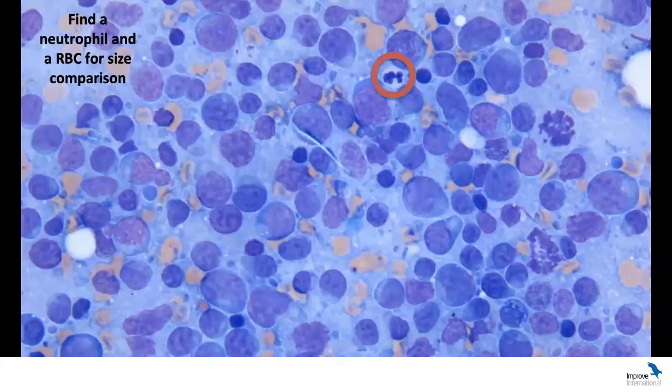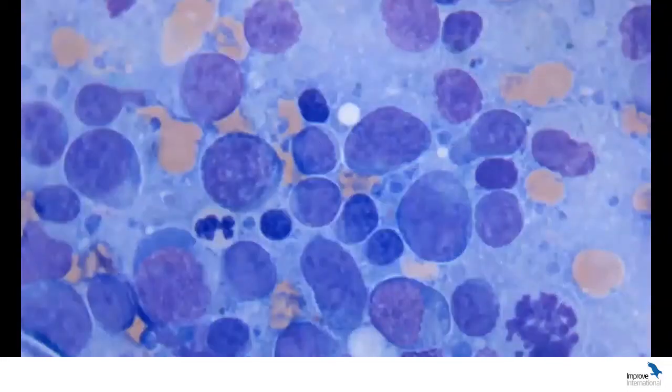Remember, in a normal lymph node, 90% or more of the cells should be the small lymphocyte. So here we clearly have an increase of the medium and large lymphoid cells and a very small number of small lymphocytes. Just again, to make that even obvious, this is as big as you'll ever see it. That's my normal small lymphocyte. That's my normal small lymphocyte. That's going to be a medium because it's the same size as my neutrophil. And the majority here are large lymphoid cells. There's also here a mitotic figure, which is atypical.